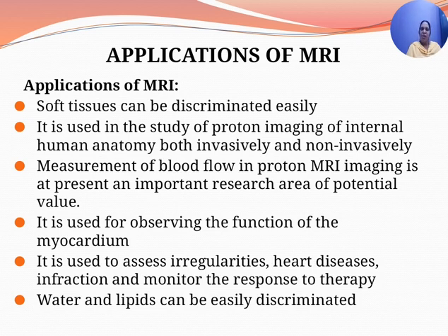Fetal MRI can be used to detect anomalies. Imaging of spine and intervertebral discs, and breast MRI for diagnosing breast lesions. Staging of cancer like rectum and cervix and prostate glands. These are the different application areas where MRI imaging is done.